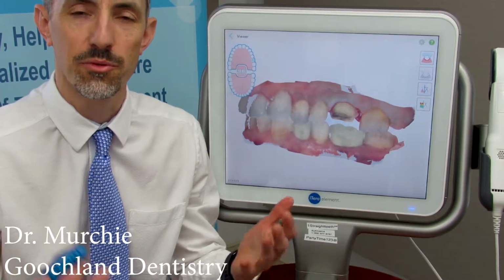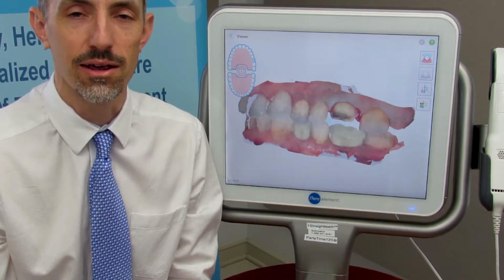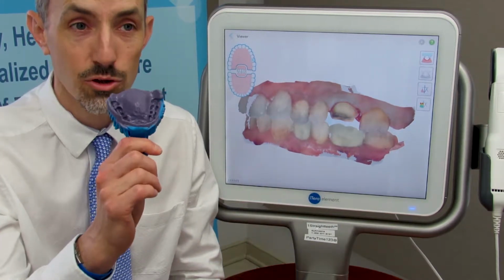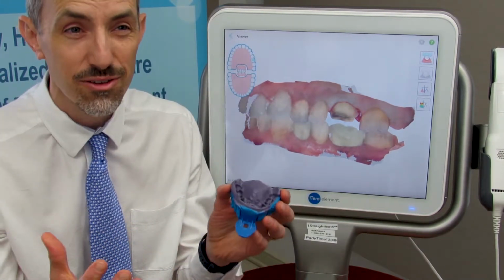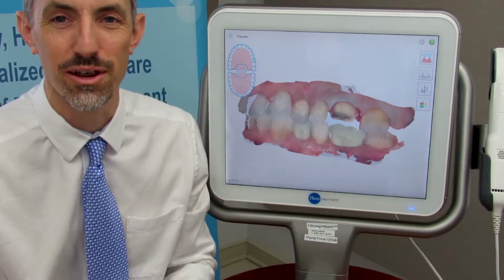I want to talk to you about something that's really exciting and very cool in dentistry. One of the things that nobody likes is impressions. You know, these things that you put in your mouth, there's a lot of goop, causes you to gag, takes about 3 minutes, it doesn't taste great, and then it leaves this mess all over your face.